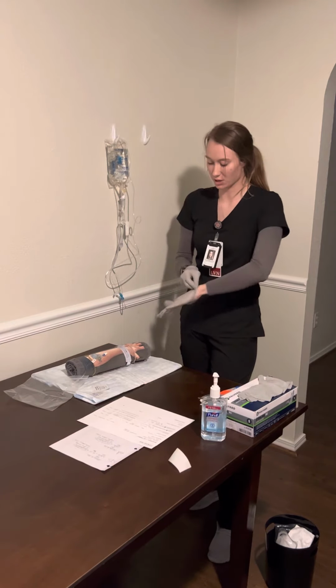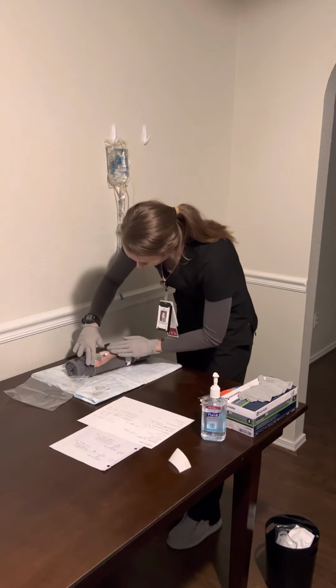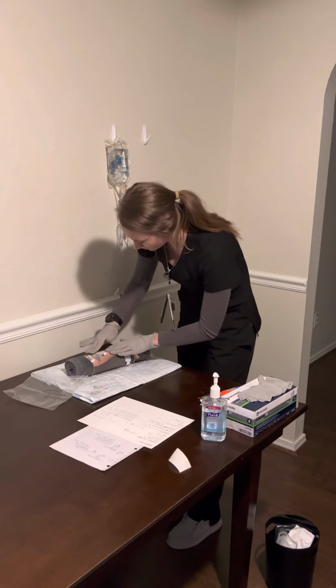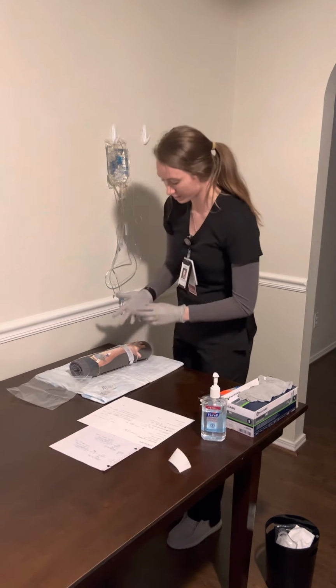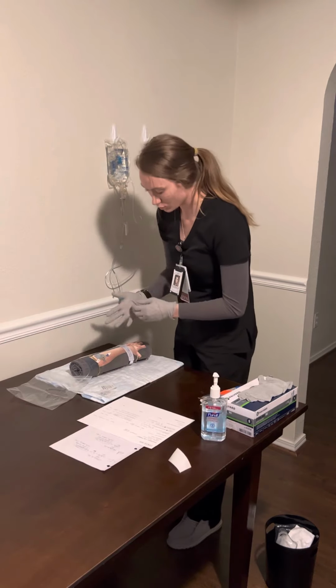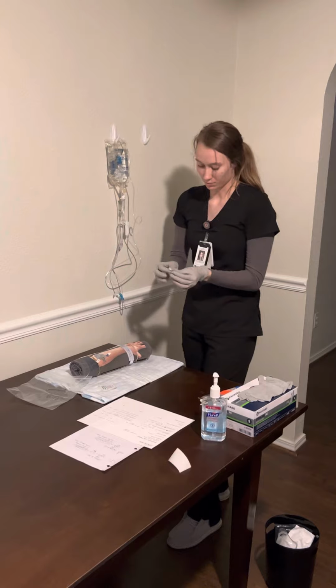And I don't need to flush this IV because it was just inserted, so we are just checking. I don't see or feel any signs of infiltration. Site is clean, dry, and intact, no phlebitis, no erythema. We're now going to connect the primary infusion of normal saline.